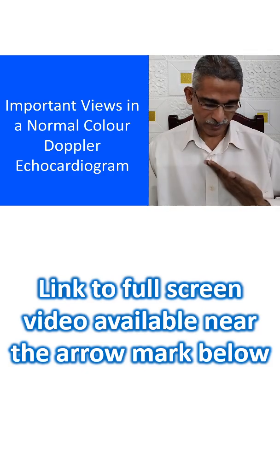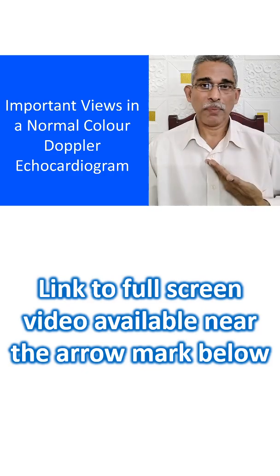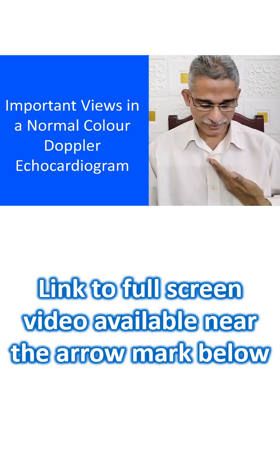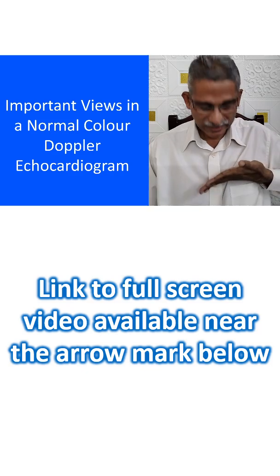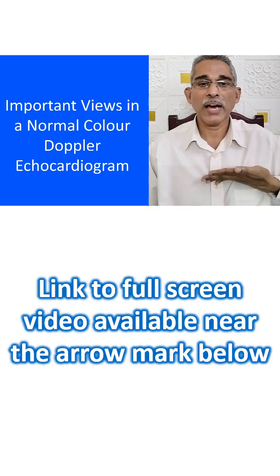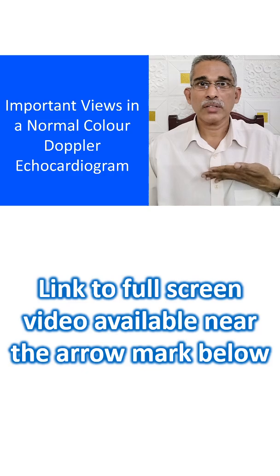For example, this is the parasternal long axis view. It goes from the base of the heart to the apex. And if you place it the other way round, this becomes the parasternal short axis view. These are the two commonly employed views initially.